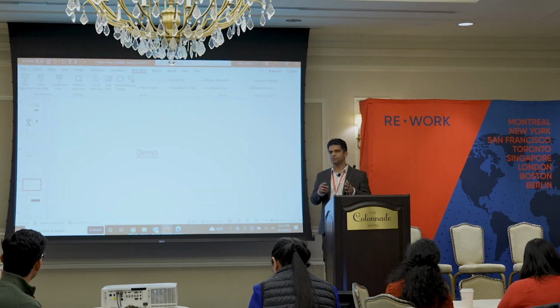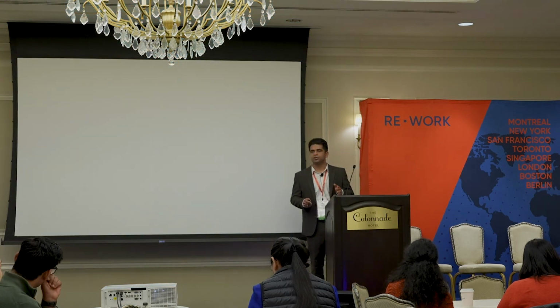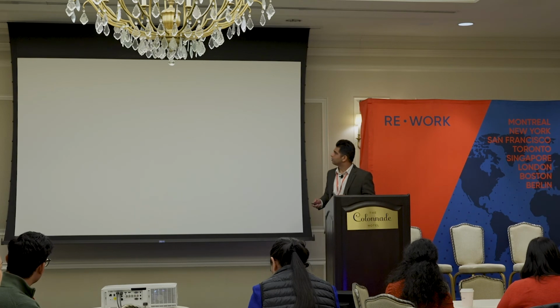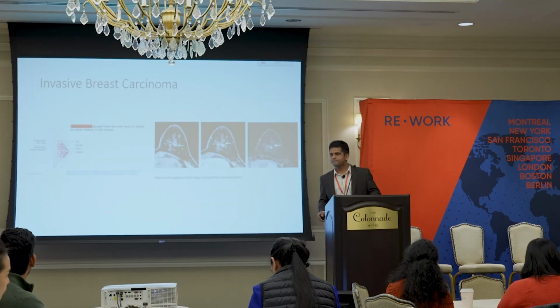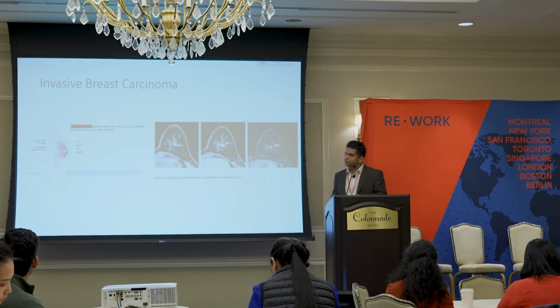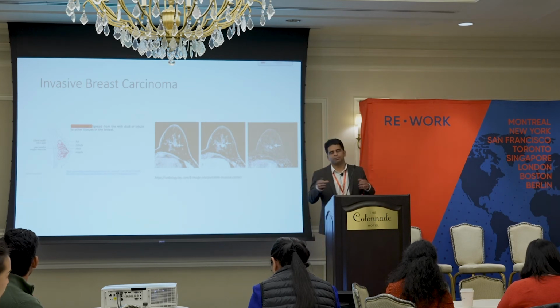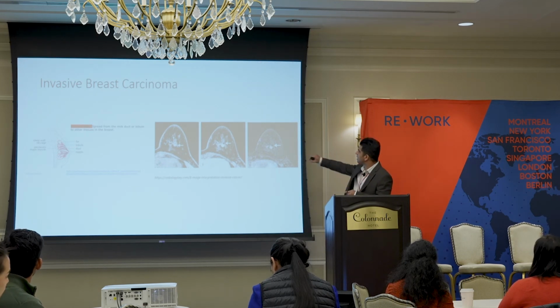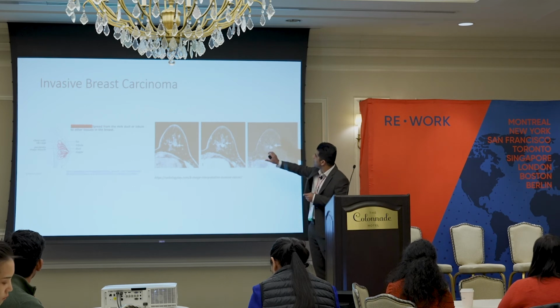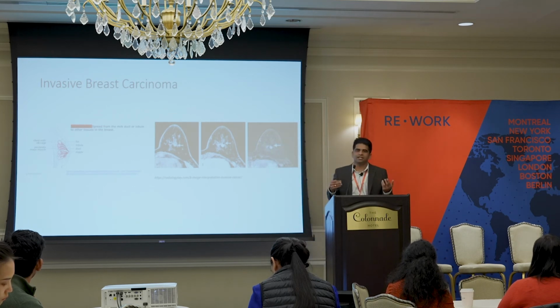So now I'll dive into some results that we achieved using this software. The first use case is invasive breast carcinoma, where the tumor infiltrates into the rest of the breast tissue from the milk ducts or the lobules. As you can see on the MRI scans, it starts at one location and then starts spreading out, which basically signifies the term invasive here.